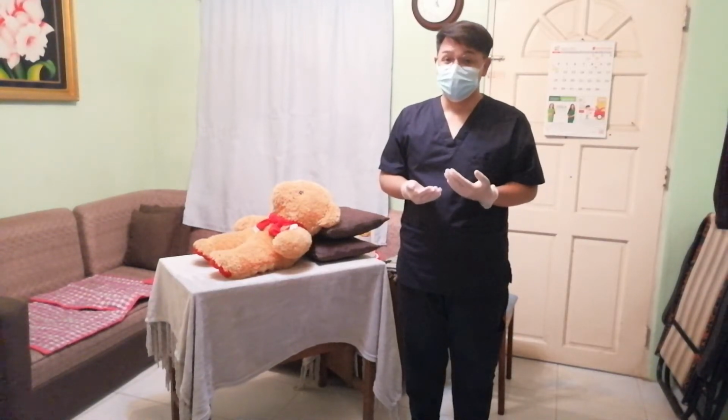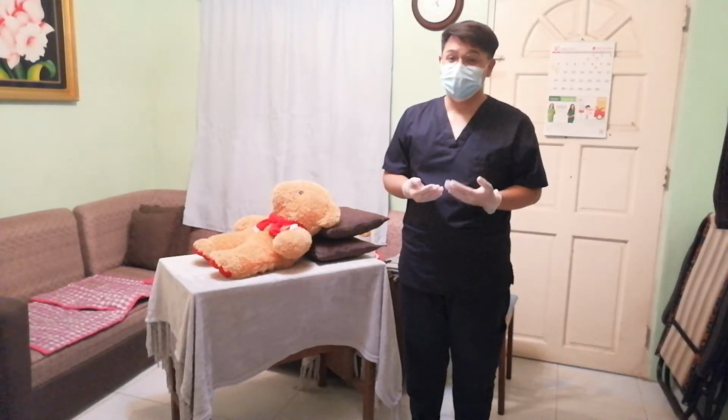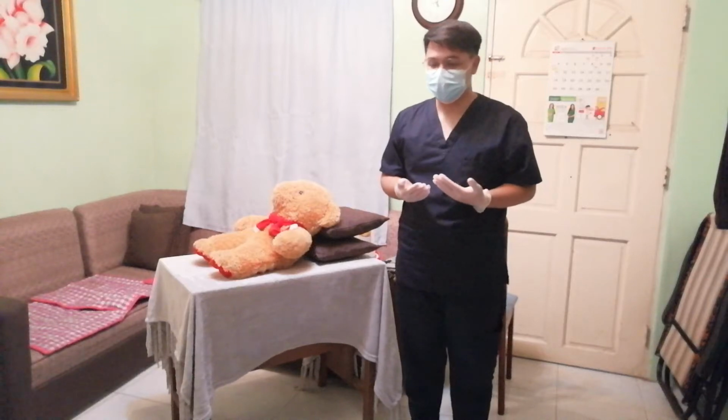For our next step, we need to move equipment to make room for the chair, and also we will be providing some privacy for our patient by closing the curtains around the bed and closing the door to the room if possible.